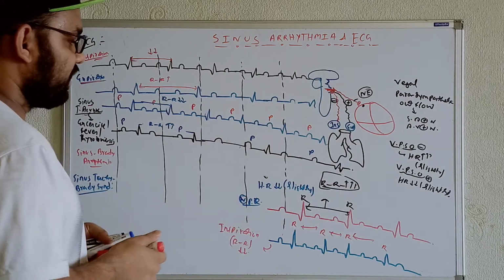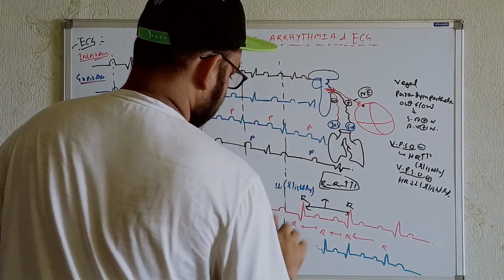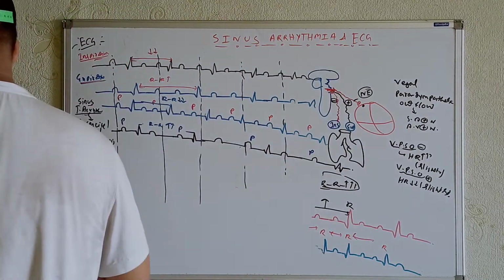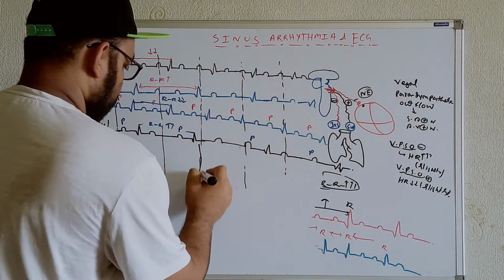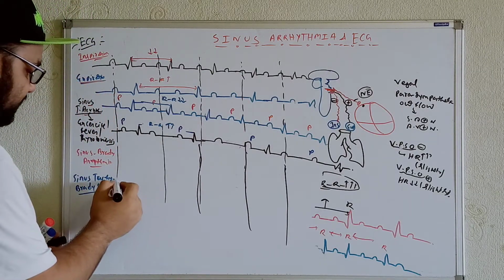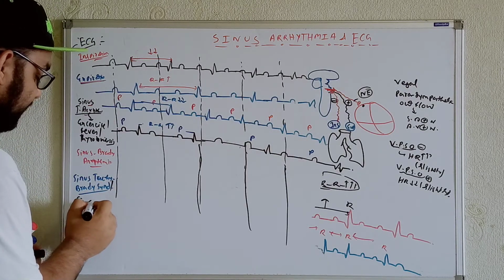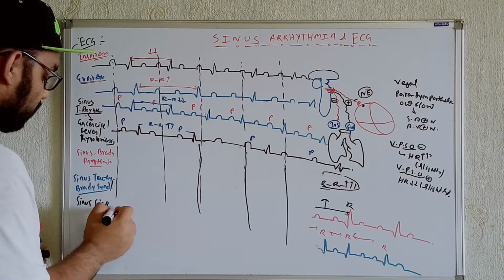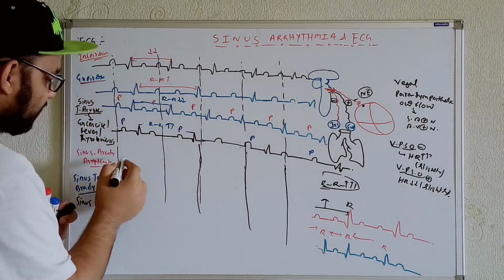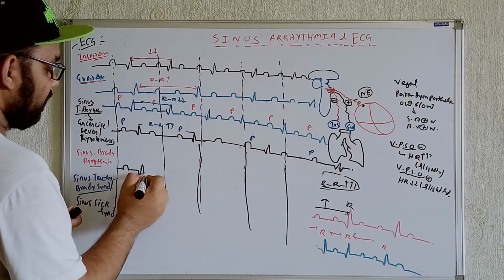So if I show you over here, it will be easier for you guys. Let me show this point over here, then it will be easier for you to understand more clearly. Now when you are talking in terms of sinus tachybrady syndrome, or sinus sick syndrome, another name for it, whatever we'll get over here, first we'll get the tachyarrhythmia. For example, I'm writing for fast heart rate. So we'll get more frequent P wave, QRS complex, T wave.